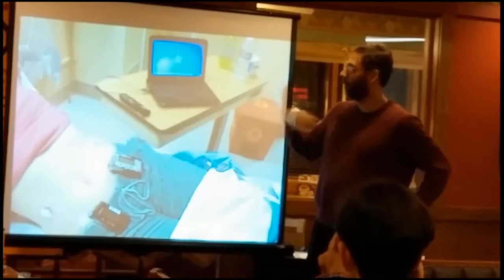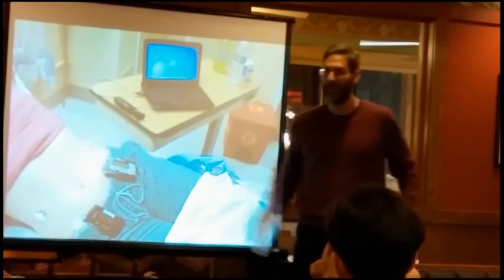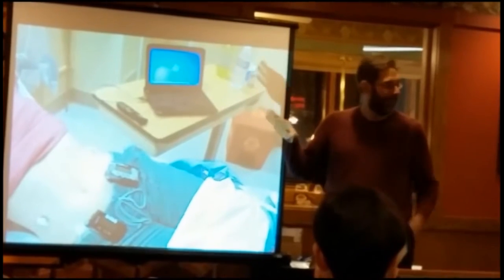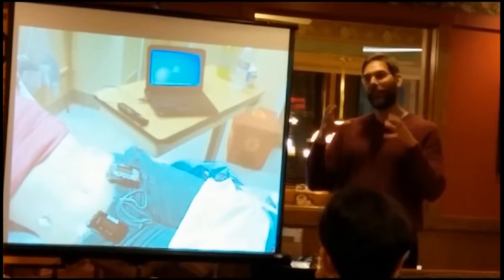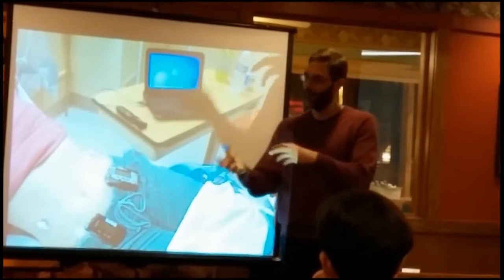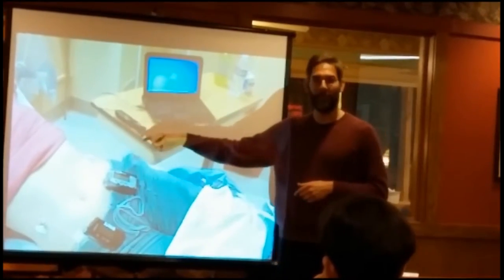So one of the projects we're working on, I hope to get started in the next few months, is working with engineers to replace that with something like this, okay? So maybe you carry your cell phone and then you've got your artificial pancreas in your other pocket, and that's in the works. And I think with all of this, everything I'm showing you here, it's going to be studied in pretty small groups. It's not going to get out to the marketplace until it's shown to work in these small kind of hand-selected people, and then all of a sudden it's going to go out into thousands of people, and that's where the industry is going to learn, hey, the people are telling us they don't like having to wear 2 things, or the sensor hurts, I'm not going to use it, or the alarms annoyed me, and I took it off.